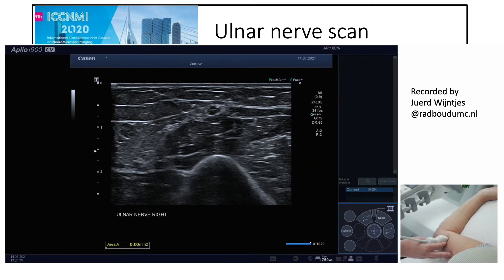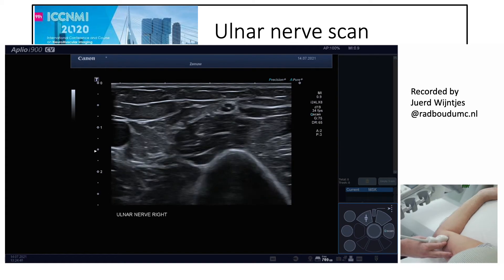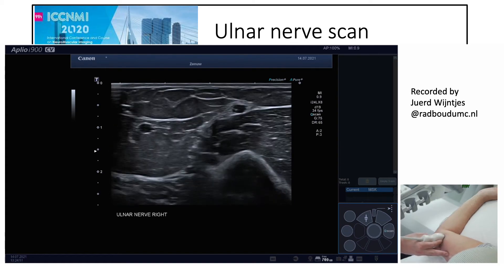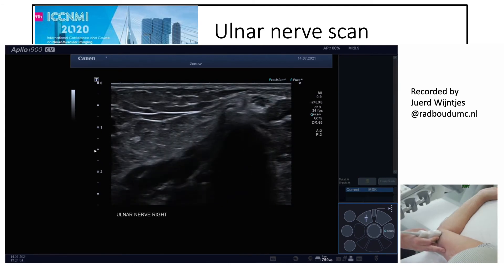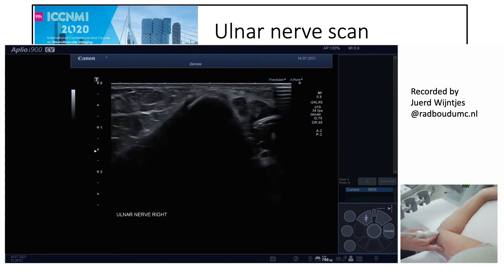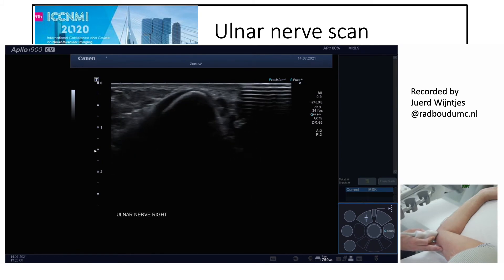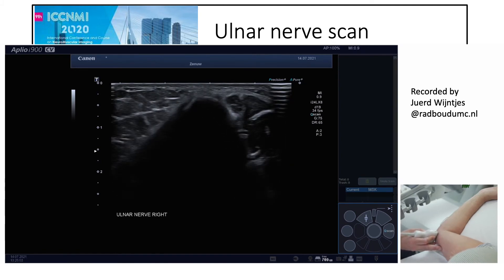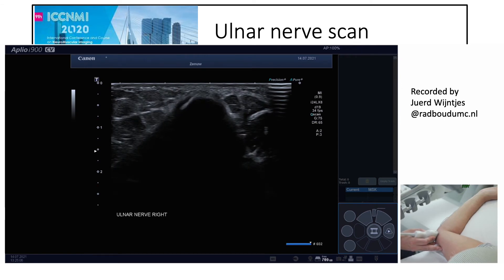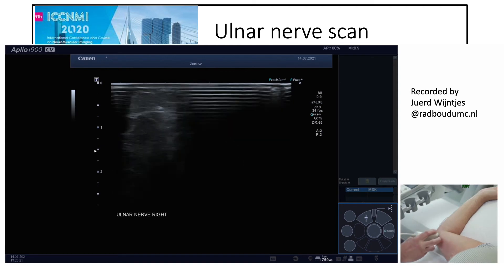We usually use the trace technique, but here you will see the utility of the ellipse measurement — it is faster but sometimes not as accurate. We move again distally towards the medial epicondyle. You can see the ulnar nerve on the right side of the medial epicondyle, and also how inaccurate the ellipse technique can be, though it is very fast.